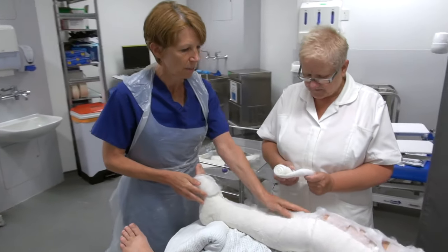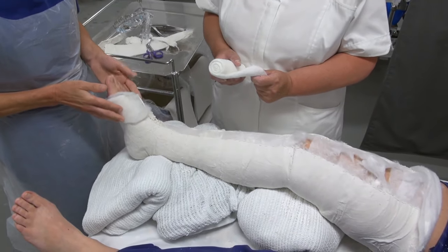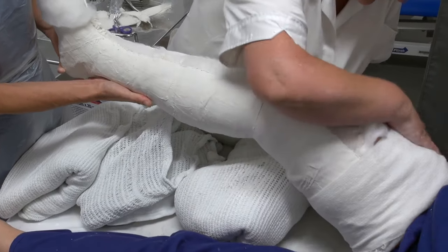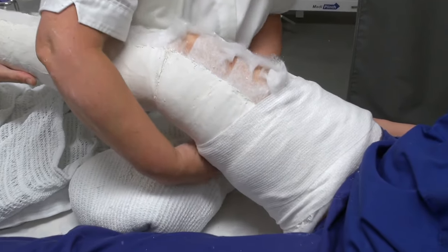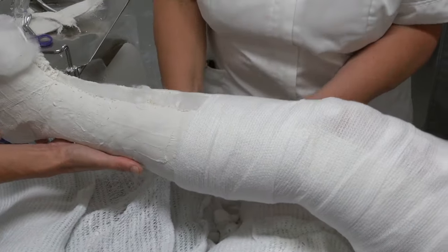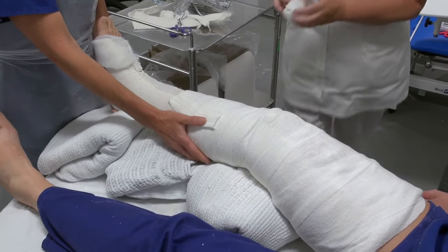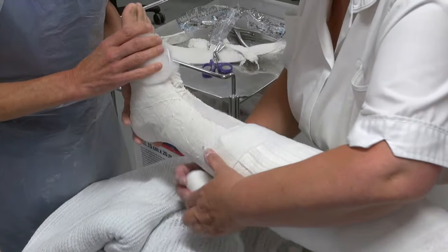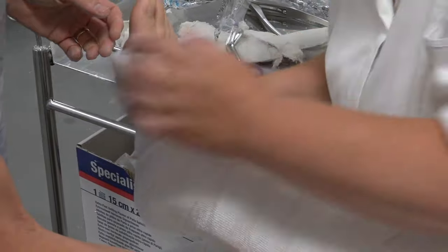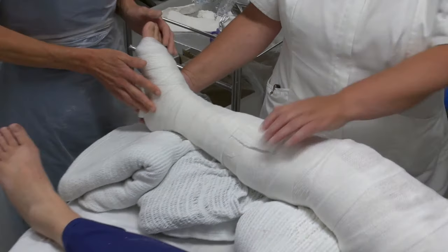As you can see now, the tram line has been removed — the middle section has been taken out and the padding has been left intact. To secure this, the patient needs to have a crepe bandage put on the leg, just to stop any undue movement of the fracture before transfer up to the ward. The bandages shouldn't be applied too tightly. The crepe bandage secures all the edges of the padding in as well, and there we are — all ready.